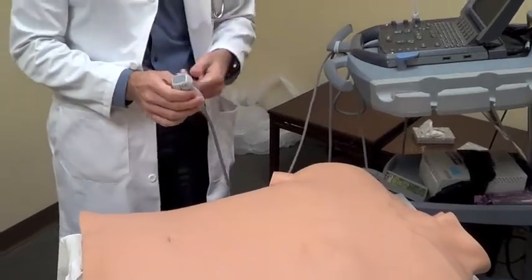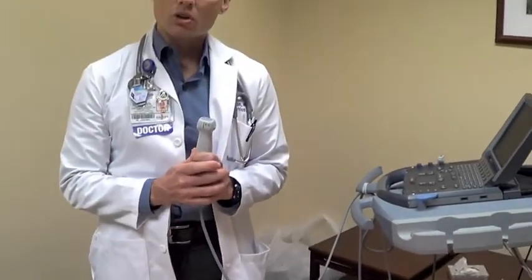There are two ways to do this. One can either use an ultrasound-guided approach for the entire procedure, which is not routinely done at this institution. The other way — the much more common technique — is to first identify the fluid collection, mark it, ensure that the patient does not move, and then access it without using ultrasound.